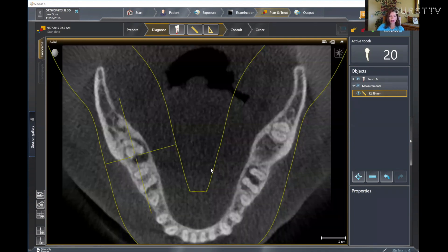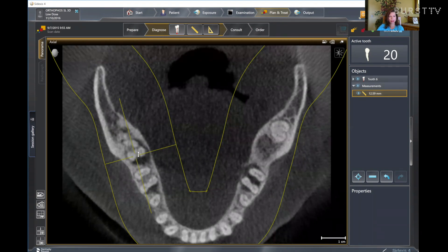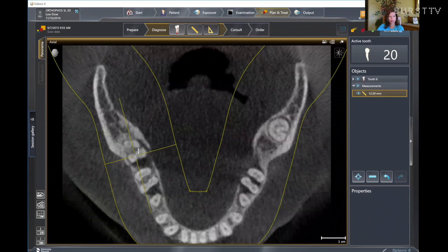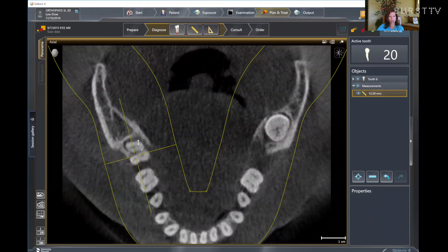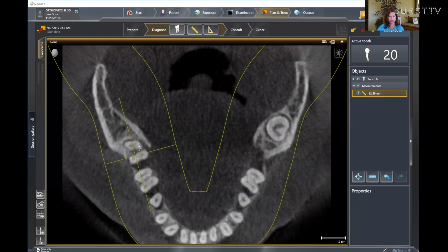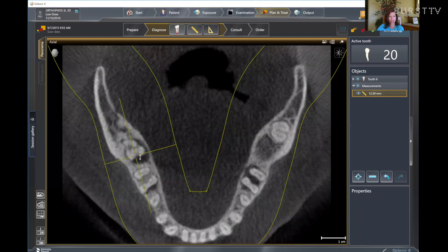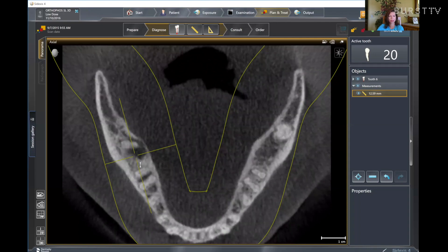Now looking at that same tooth in the axial view — look at how much bone loss surrounds that area. Not only from the buccal side and the mesial side, but it goes all the way into the lingual side as well. This gives a better assessment of the total amount of bone loss in that area as we scan through the image.